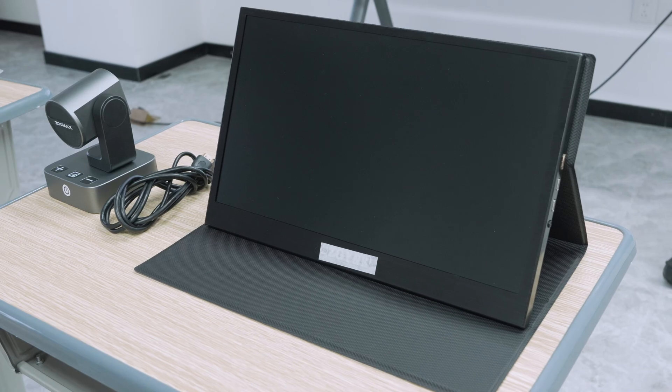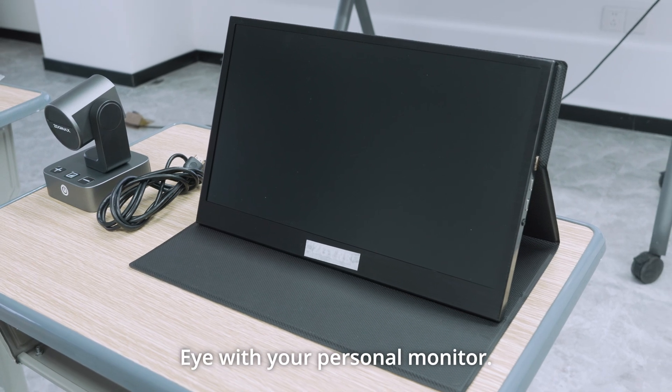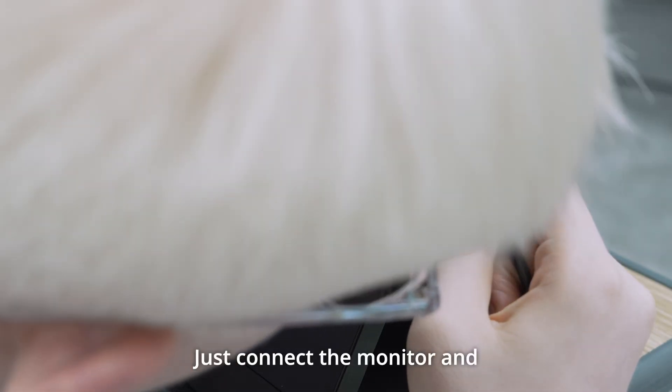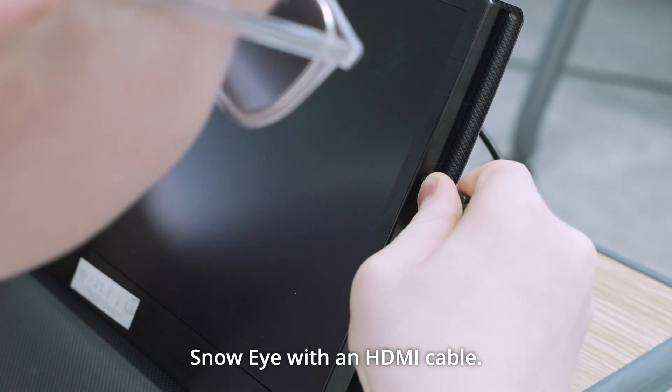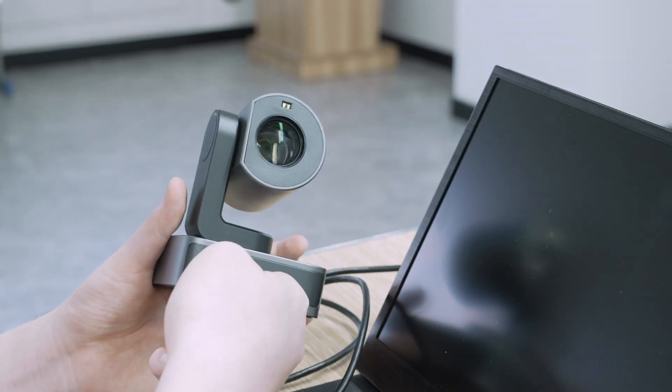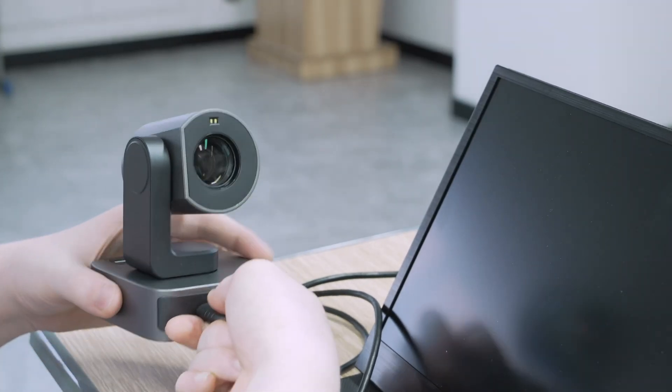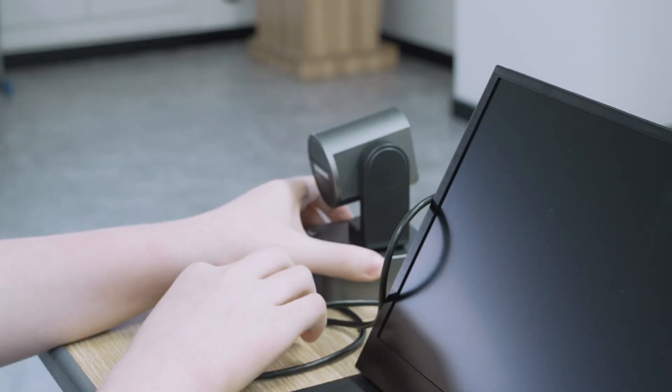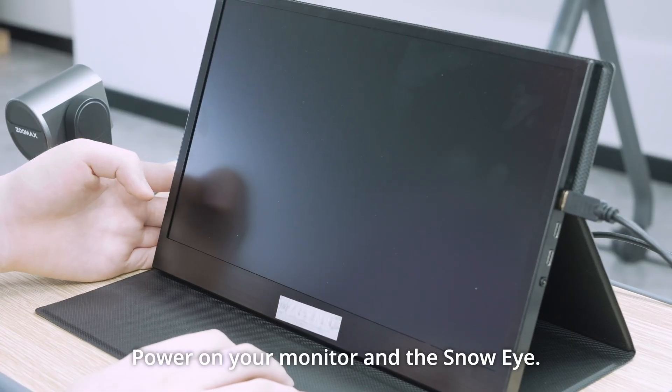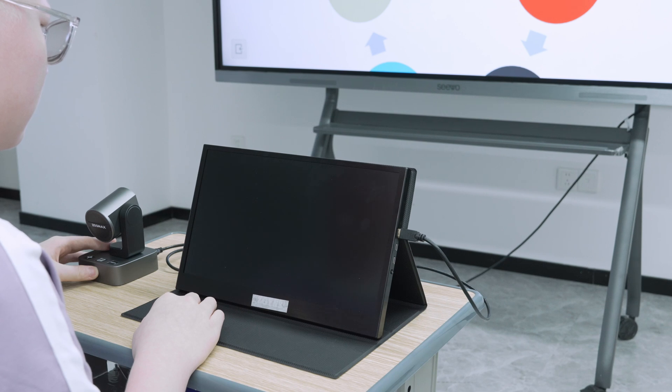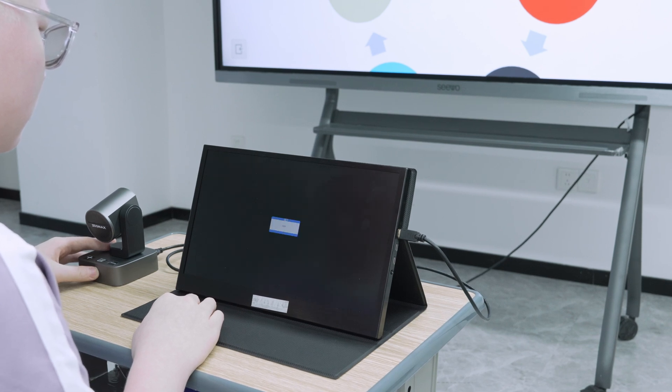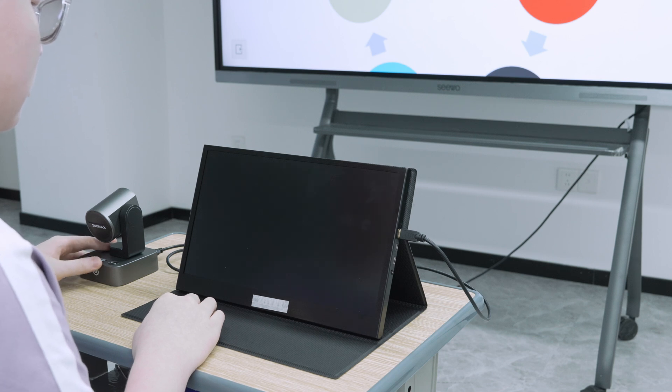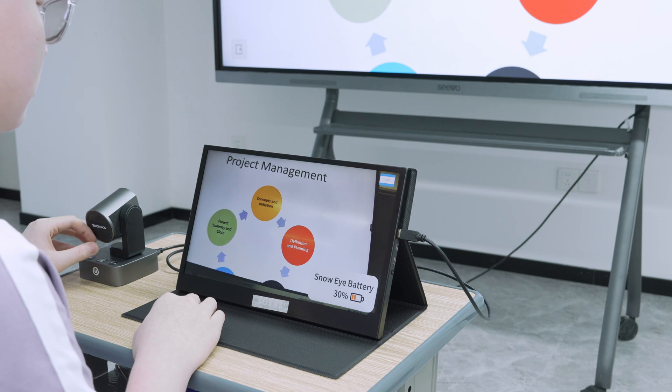Connect Snow Eye with your monitor. You can also connect Snow Eye with your personal monitor. Just connect the monitor and Snow Eye with an HDMI cable. Power on your monitor and the Snow Eye, and you get access to distance viewing.